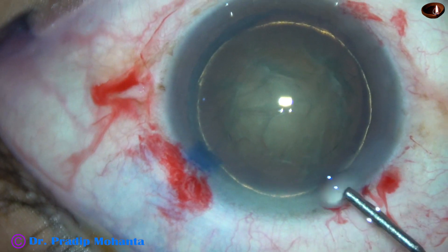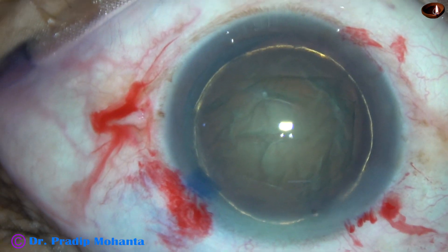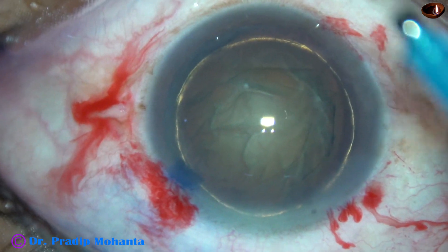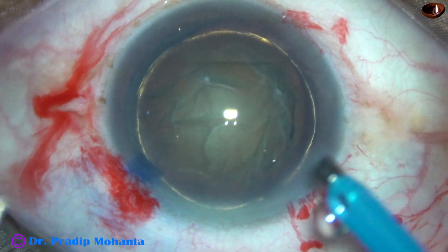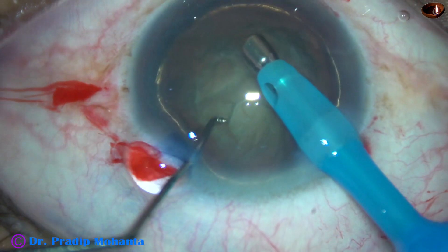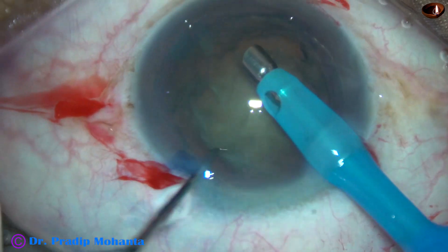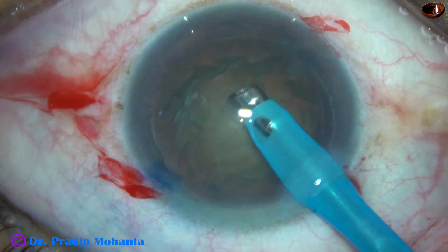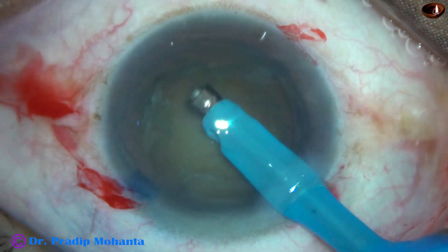And now some more viscoelastic. The tip of the phaco needle is to be introduced now. The machine being used is the Optikon Catarix 3 from Switzerland. The tip goes beveled down. Some superficial cortical lens matter is removed. Since the nuclear sclerosis is about grade 3, it is very easy to hold the nucleus and chop it into fragments.